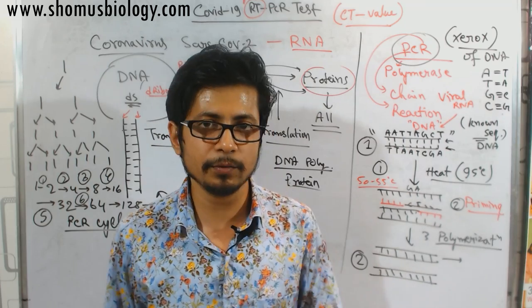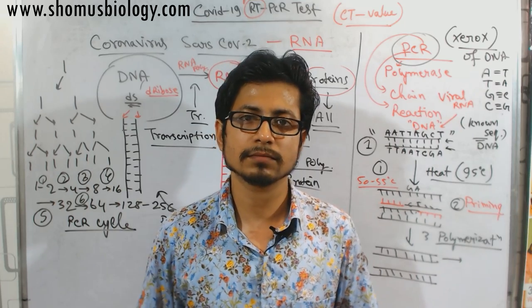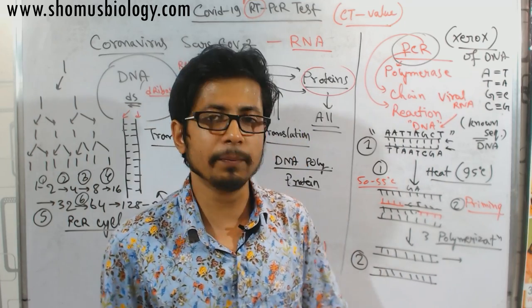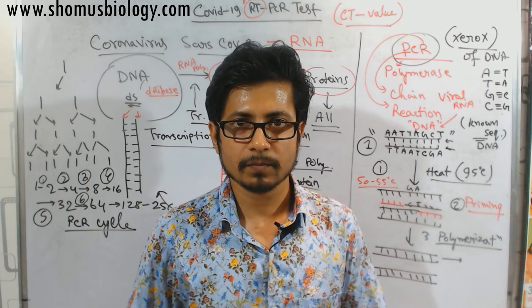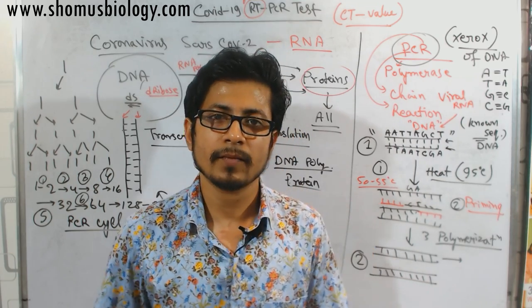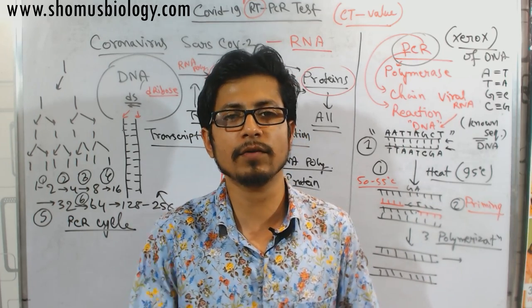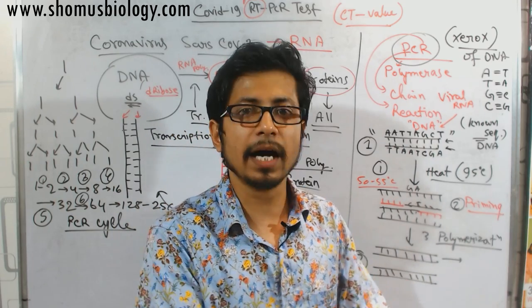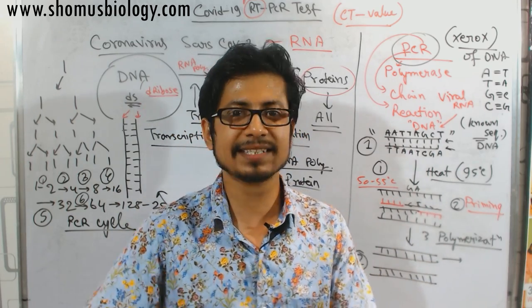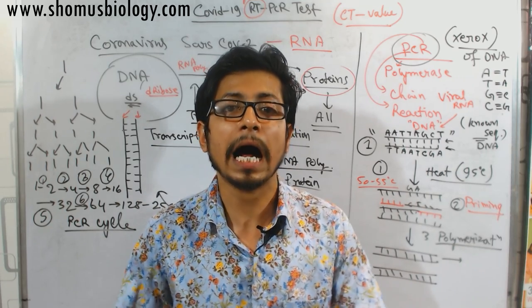So as per this value we can say that yeah, Ram is more affected by this virus than Sham. True. Now let's compare Ram with another person, X. Ram has a CT value of 20, X let's say has a CT value of 25. So comparing both, what you can tell is that yes, Ram is more infected, X is less infected. But no, you cannot comment on how the infection is there.